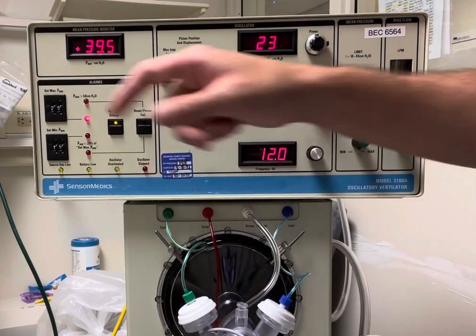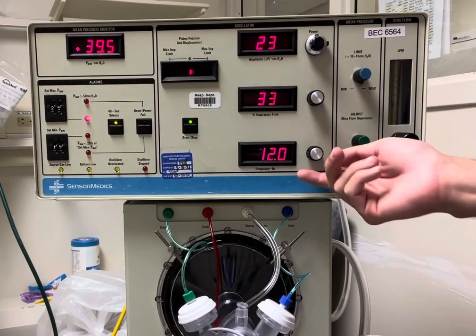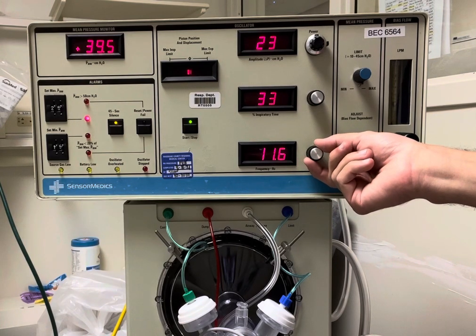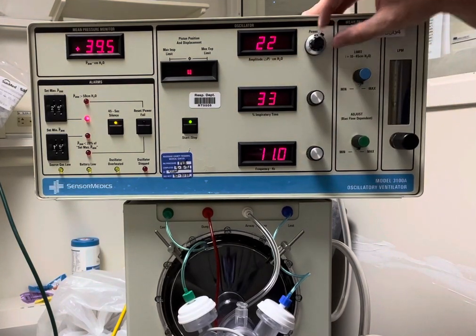The alarm silence is there and the reason why it's alarming is because my alarm limits are off. I can go ahead and adjust my settings accordingly. I have frequency, my hertz, my inspiratory time percent, and then I have my amps, which I adjust by unlocking it and adjusting the power button.